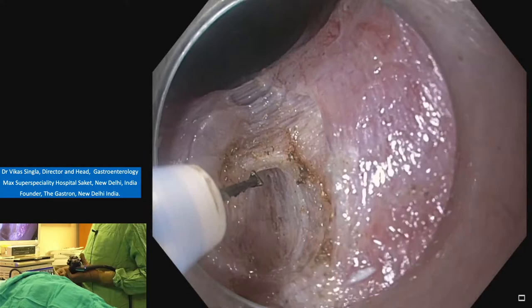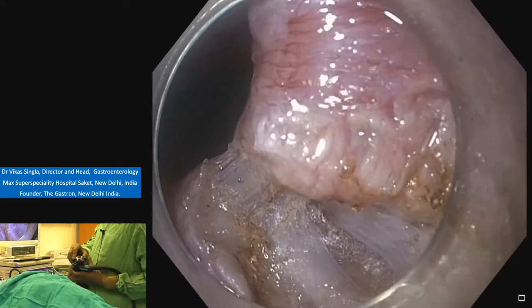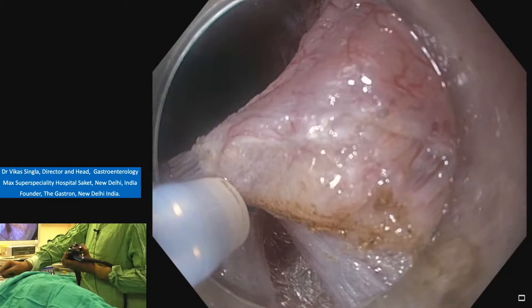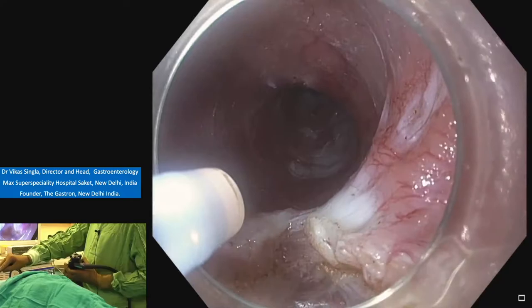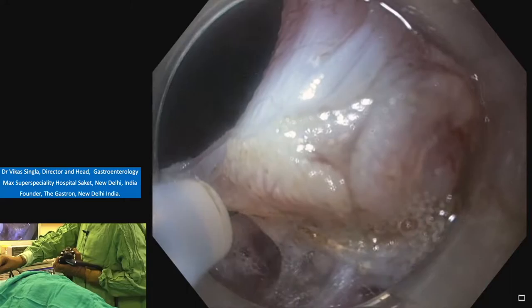Again the same trick. Coagulation. Then lift and cut. And we can see some spontaneous cutting of longitudinal layers. That happens because it's a very thin layer. You go below it, you can see the advantage here, below the longitudinal layer, coagulation, cut. Mostly we end up doing the complete myotomy. Again, below it, coagulation, and then cut.